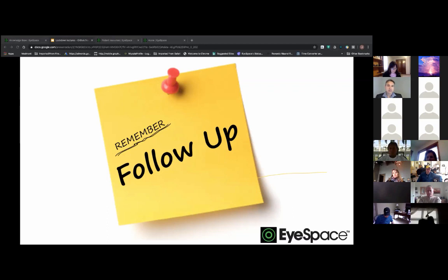I will see if there's any staining. How's the health of the cornea doing after an overnight wear? Is this a good candidate for overnight wear? Then I will go to do topography. Now, if there's decentration on the topography, then I'll go back, pop the lens in and see if I can figure out what's going on.